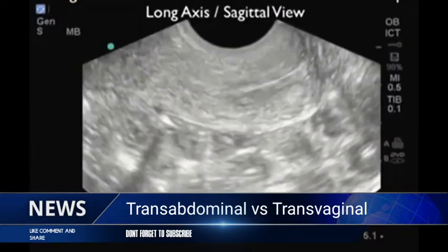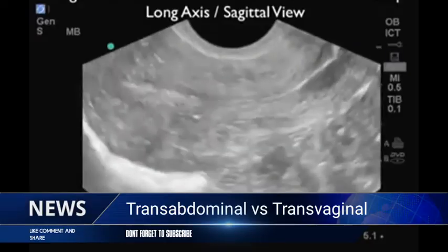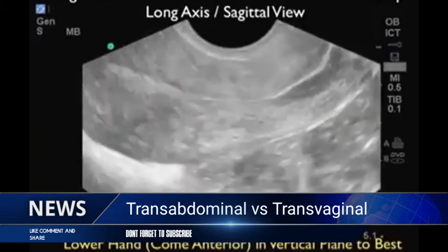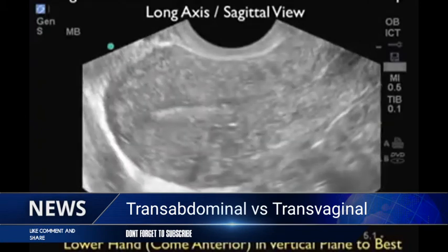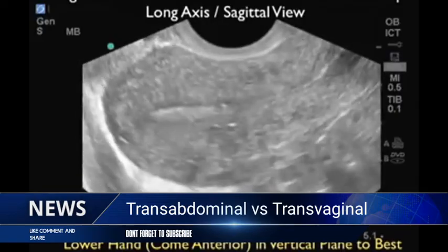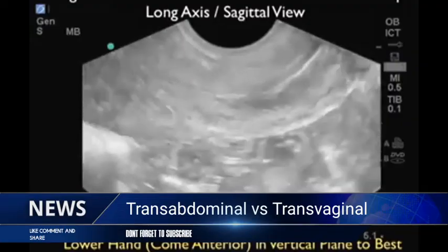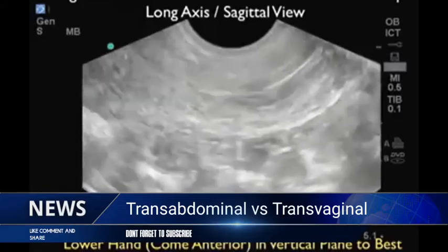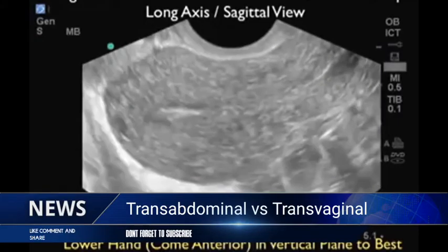Here's a resulting ultrasound image as taken from a transvaginal approach, long axis or sagittal view through the female uterus. And we see the two portions of the cervix well seen on bedside sonography in the middle of the image here. Now notice as I swing the probe more anteriorly, I'm going to bring the fundal region of the uterus into view. So if I angle the probe more posteriorly, there I have cervix, and more anteriorly, or dropping my hand, as I'm doing now, I'll best bring the fundal region of the uterus into the ultrasound image. So again, cervix, down to fundus, dropping my hand, and orienting the probe more anteriorly, so it's going to best image through the top part of the uterus.